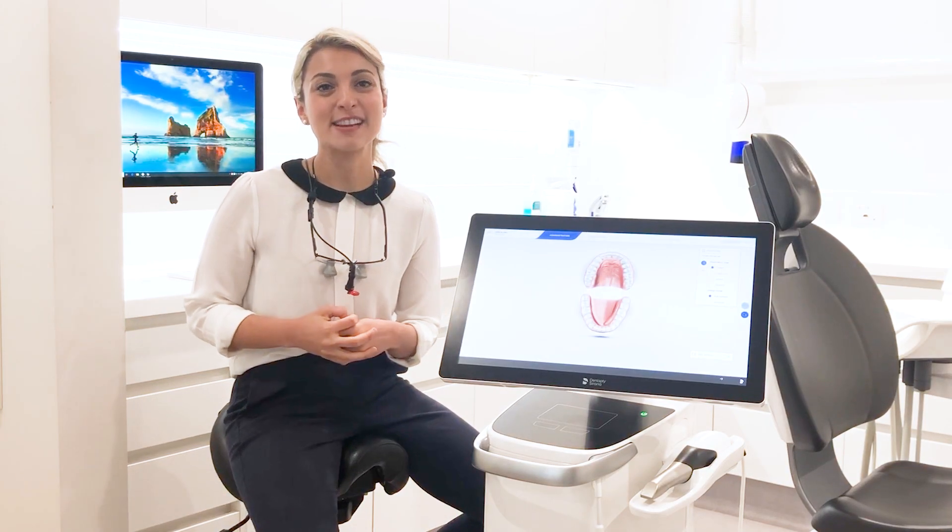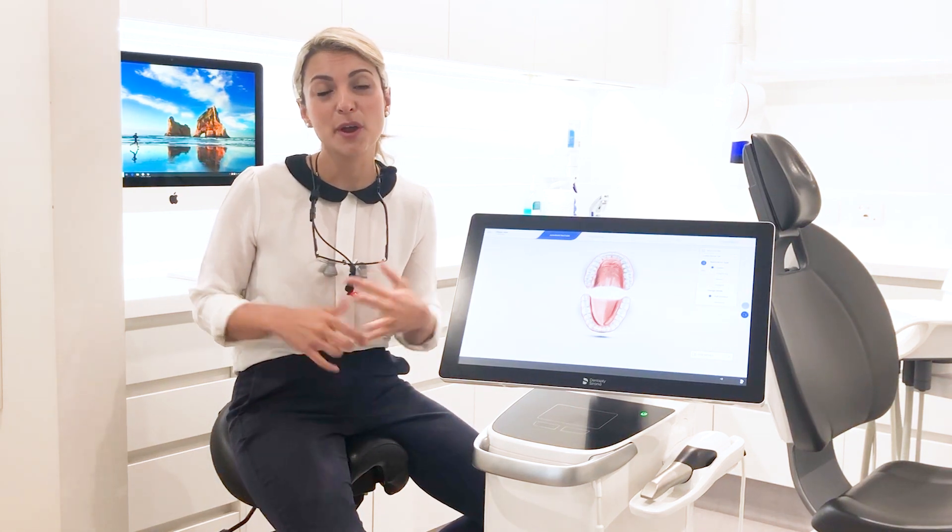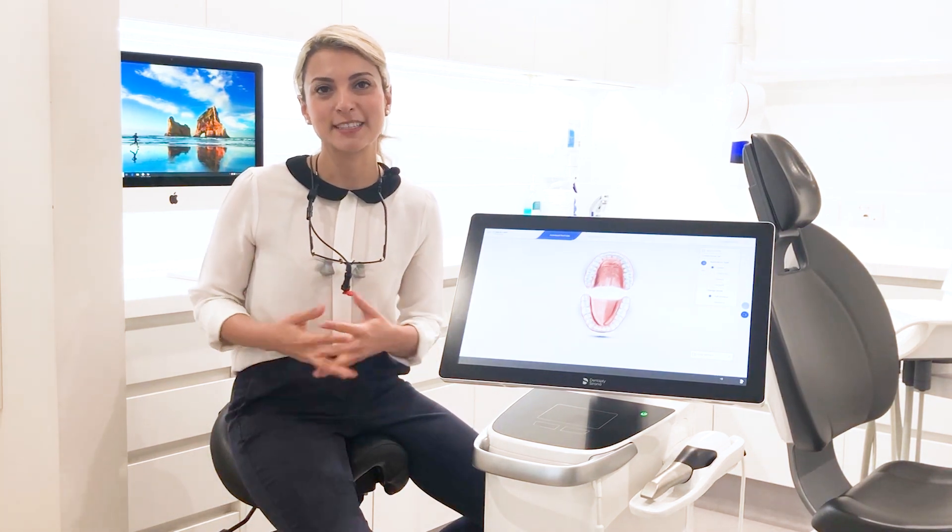Chances are at some point in your life you'll need an impression taken of your mouth. Impressions are used for a variety of reasons — things like mouth guards, night guards, orthodontic treatment, crown and bridge work, as well as planning for cosmetic dental work.